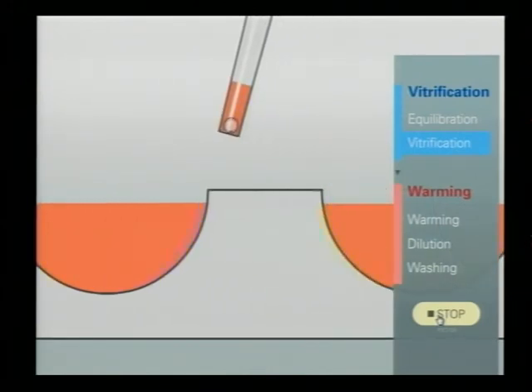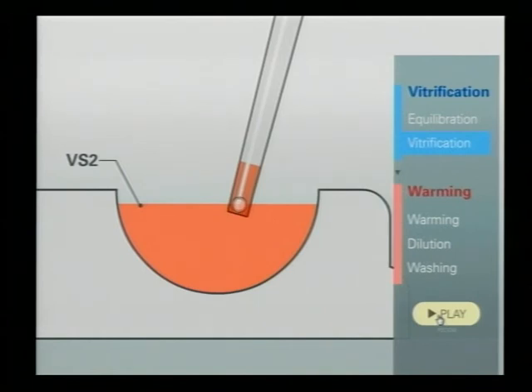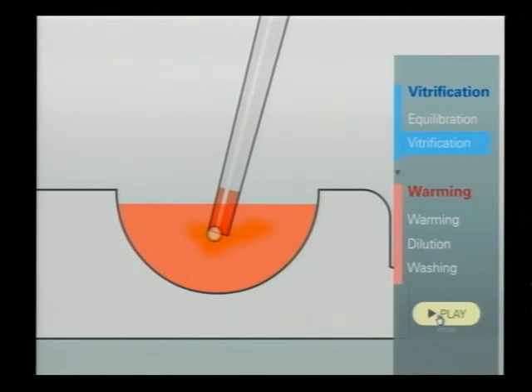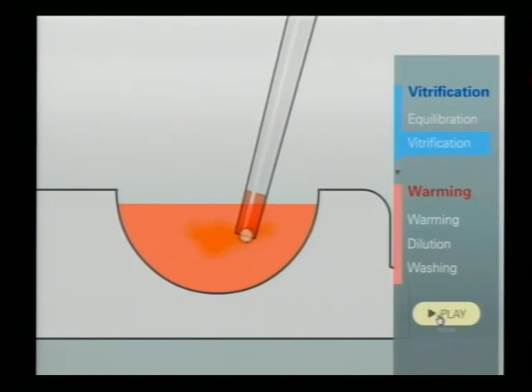Complete exchange of the solution is already completed, so the third one is just confirmation, mainly for the beginner embryologist. Just take it, throw and mix. We mix because we can see the shrinkage of the oocyte by 3D, to confirm the shrinkage in many sides, many directions. So just wash and confirm the shape is flat.